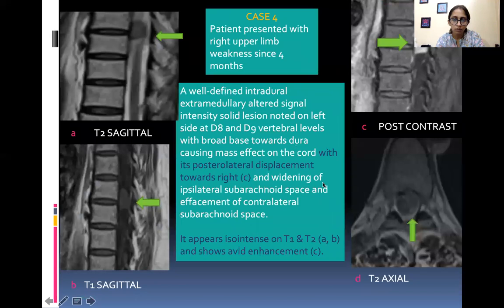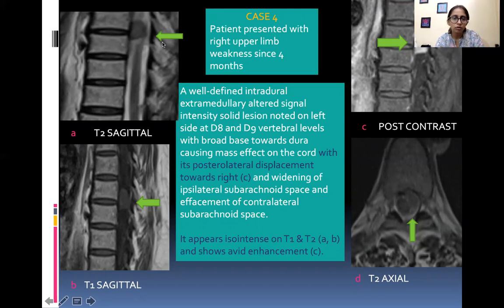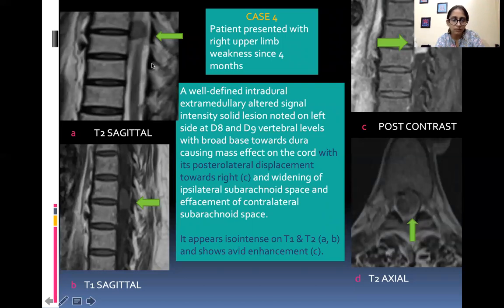Presenting a case of meningioma: patient presented with right upper limb weakness since 4 months. A well-defined intradural extramedullary solid lesion is noted on the left side at D8-D9 vertebral level with a broad base towards the dura, causing mass effect on the cord with posterolateral displacement towards the right, widening of the ipsilateral subarachnoid space, and effacement of the contralateral subarachnoid space. It appears iso-intense on T1 and T2 and shows avid post-contrast enhancement.